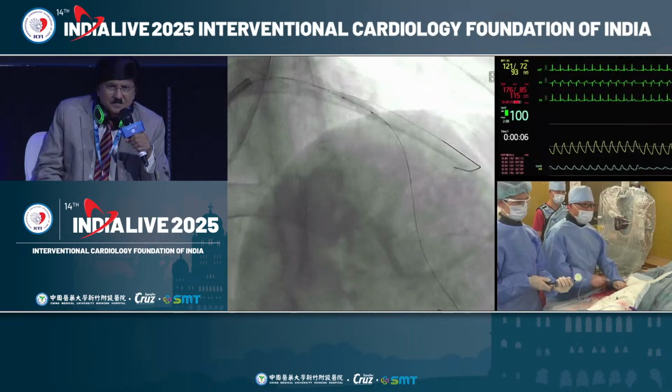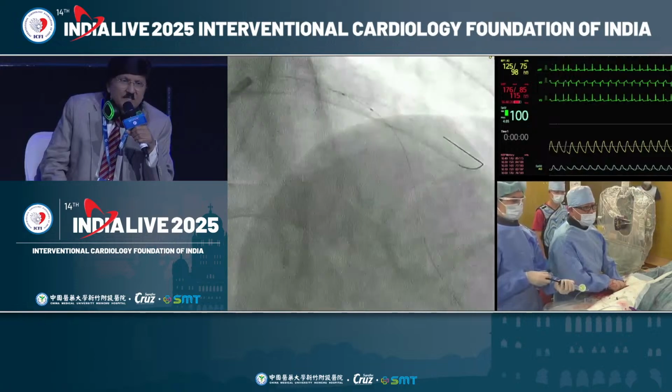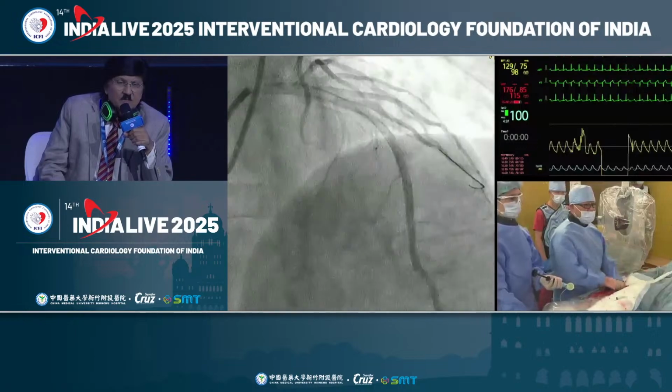So no need. Okay, now it is completely dilated there. Yeah, gradually. Yes, it's better now. Okay, check once at the moment. Okay, very nice.